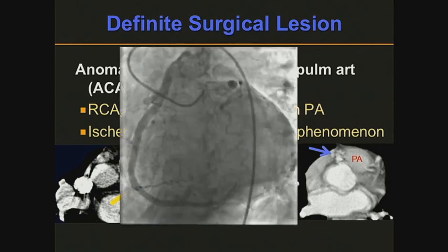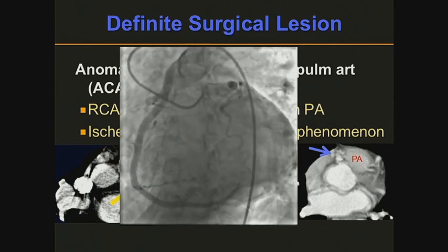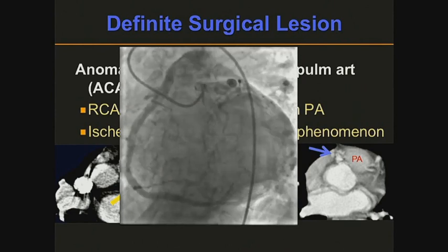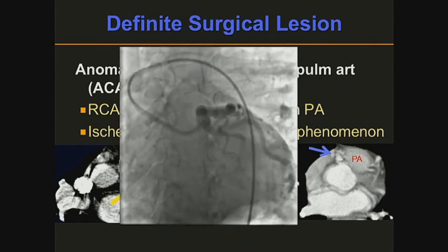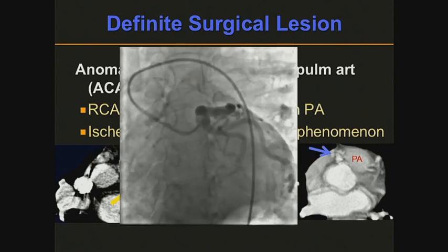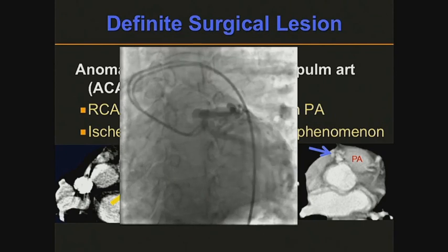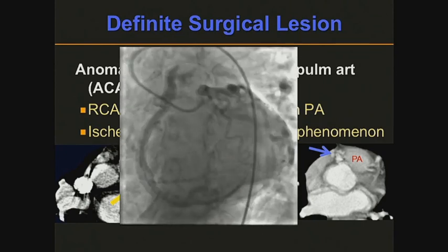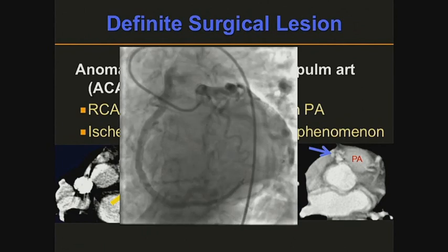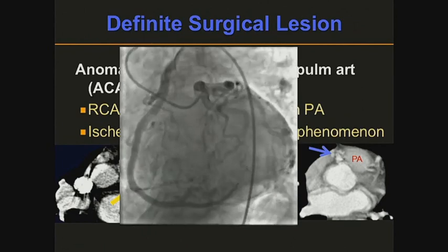And here's a coronary catheterization of the same patient. Here you can see that the catheter is going into the ostium of the left main, so it's a selective injection into the left main. And then through the LAD coming into collaterals, you can see it's going upward into the RCA, and that little, what looks like a waterfall, is it's going into the pulmonary artery. So I'm just going to let this loop again. Come down here, collaterals upward and there. So you can see the direction, even though the anomalous origin is really the RCA.